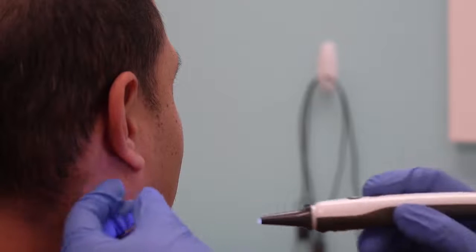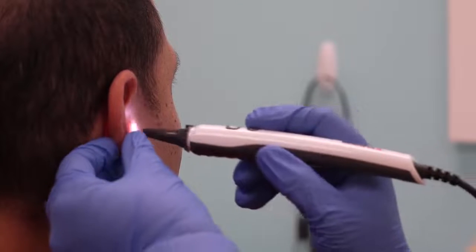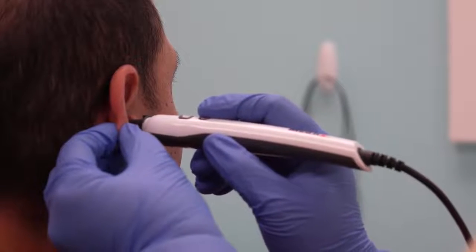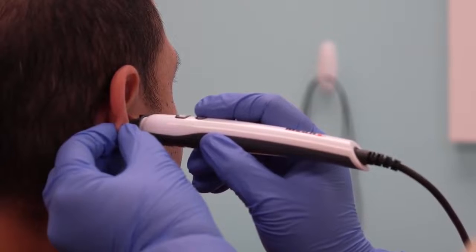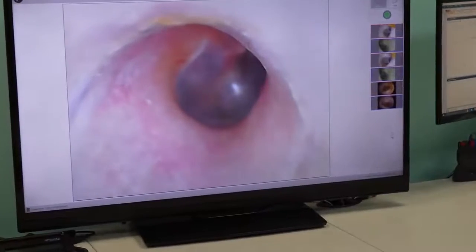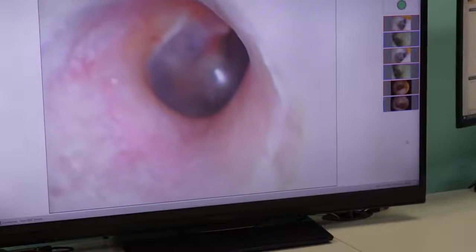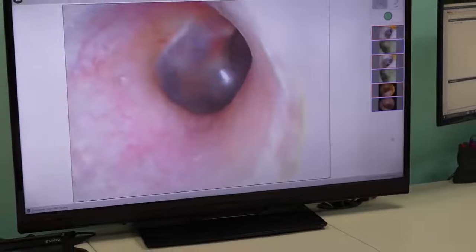Always perform an otoscopic examination of the ear canal prior to testing to determine if earwax or other foreign matter will interfere with probe tube insertion.